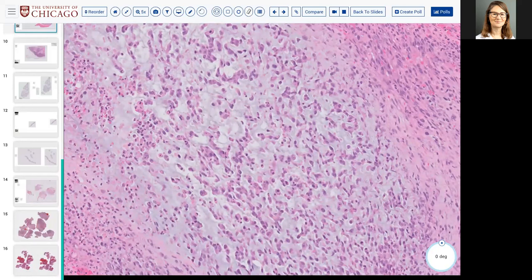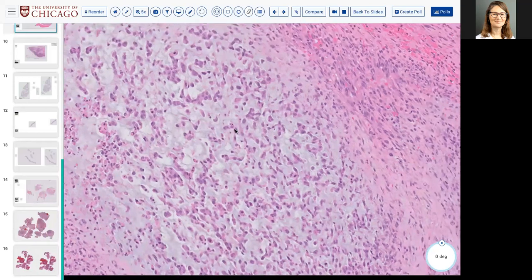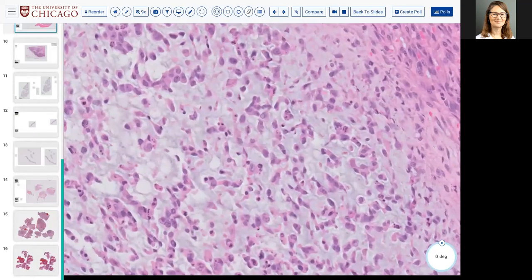And so, yes, these additional immunomarkers are some of them. Whereas epithelioid sarcoma is really keratin and INI1 dependent, you now also have to add on to this case: this certainly should be positive for either a keratin or an EMA, right?